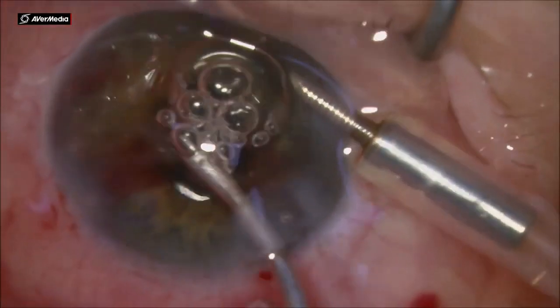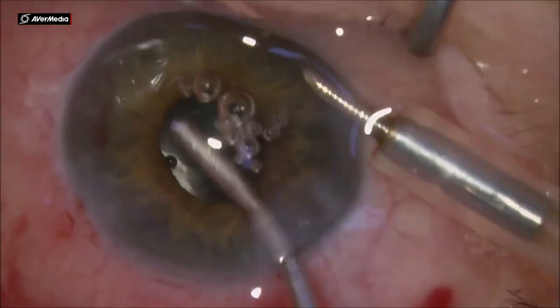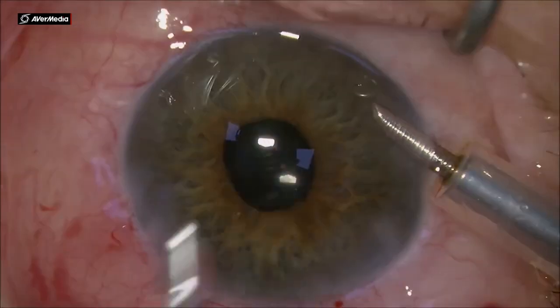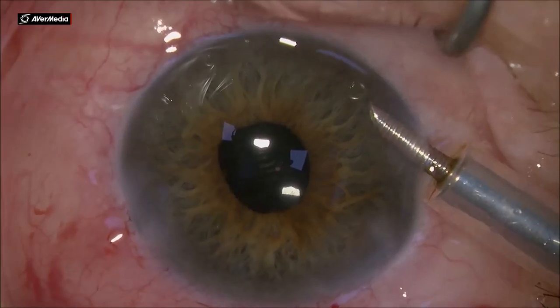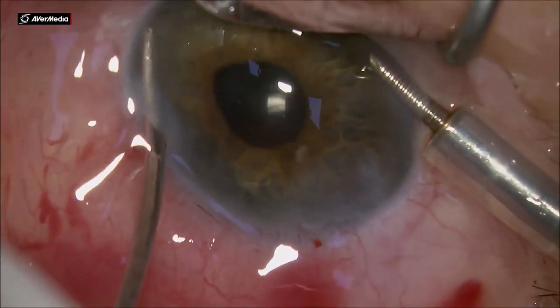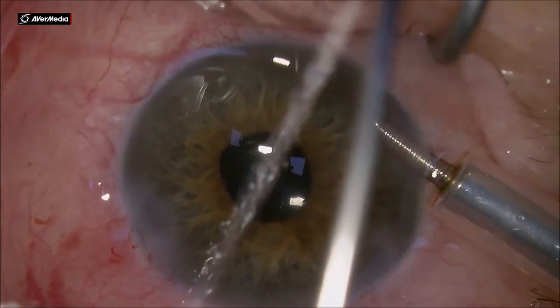That blood coming from the trabecular meshwork is the patency that proves that the cut was good. Thank you for your attention.